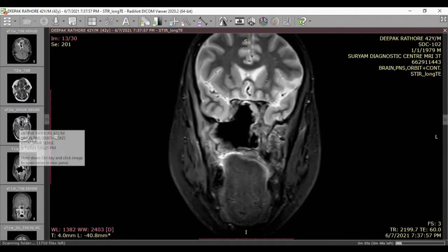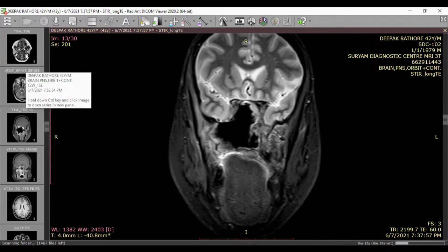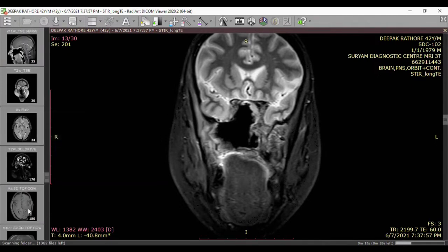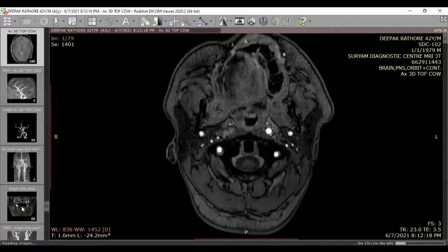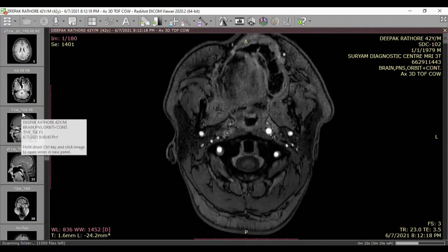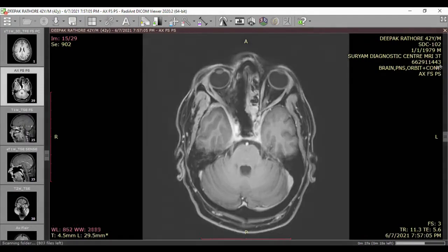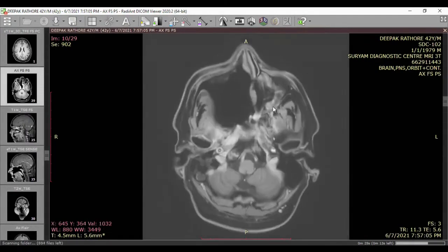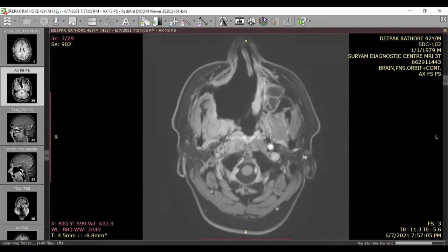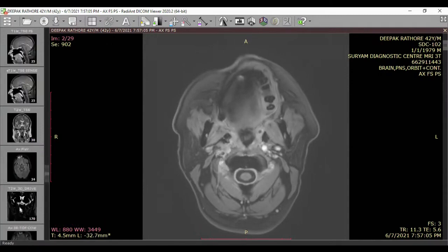Now, this patient, see this, because of the mucor vasculitis, the carotid got blocked, completely blocked, and developed multiple infarctions. We have the angiogram also to show you. See this, first of all. That's the carotid artery on this side, and this carotid artery has a thrombus, not enhancing. This was a complete blockage of the carotid artery, which gave him problems.